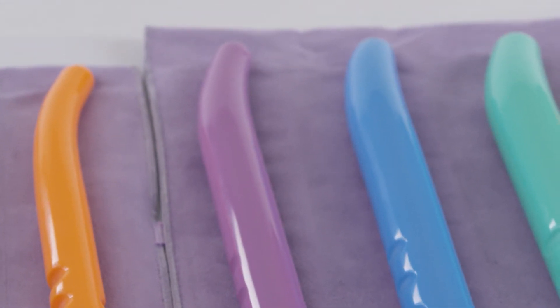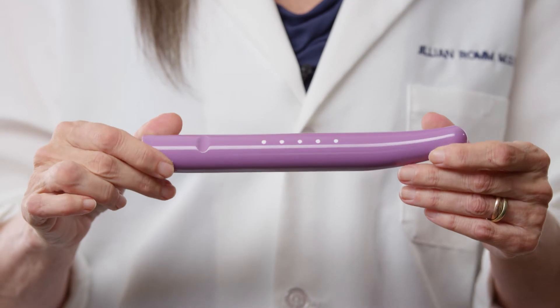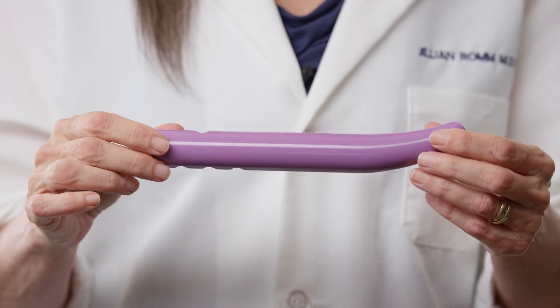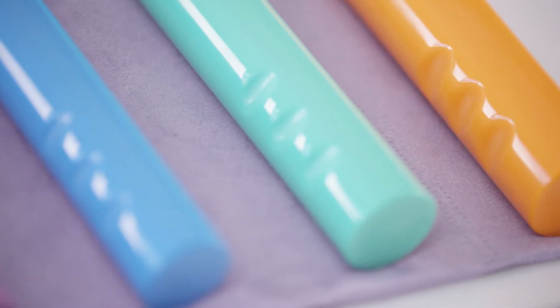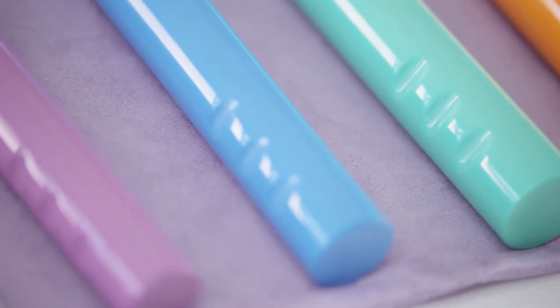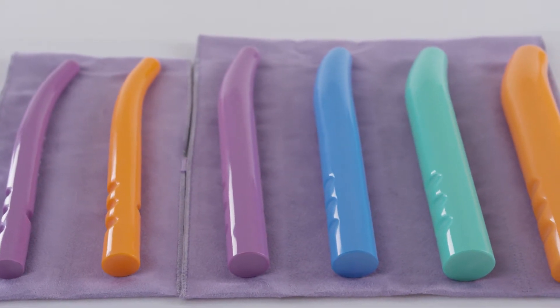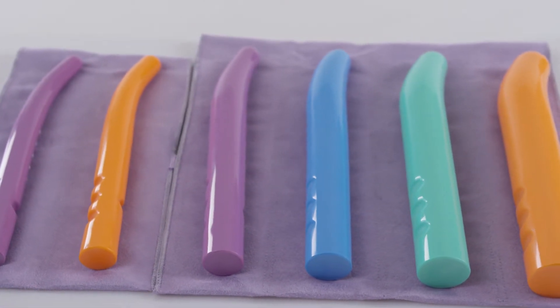They also have a comfortable grip and unique depth markings to assist you in measuring your progress. Your surgeon may give you specific instructions regarding depth of dilatation. The GRS dilators are designed for easy use and evaluation for both you and your practitioner.